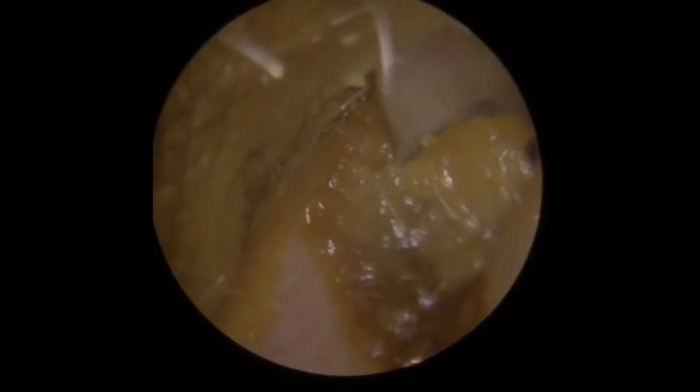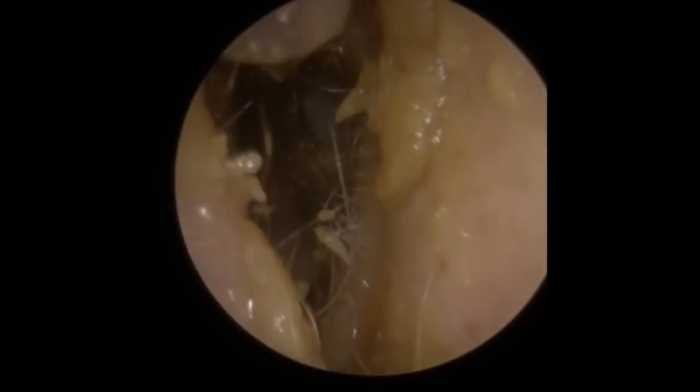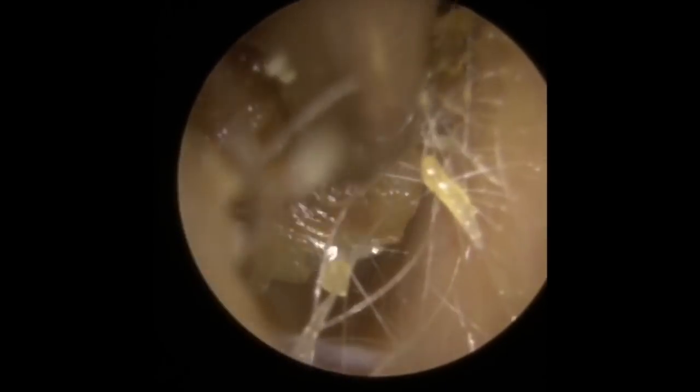This is the other side — the same patient with the other ear. There was a little bit of wax in here, so we showed the patient what was going on and they asked if we could remove it at the same time. This isn't causing any problems on this side — the patient wasn't even aware they had any wax here because there is quite a large hole in the wax, meaning sound can get through to stimulate the eardrum. We're sticking with the standard size Zollner tube, working on the wax at the entrance to the canal first. It was jutting out quite a way, and the wax can be connected from the front end right the way to the back, which is what's happened here.